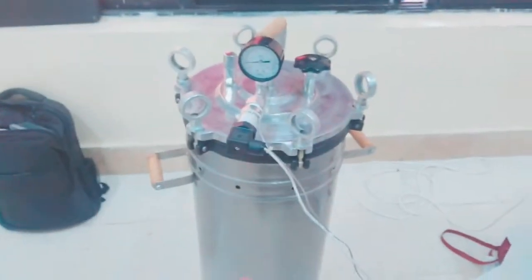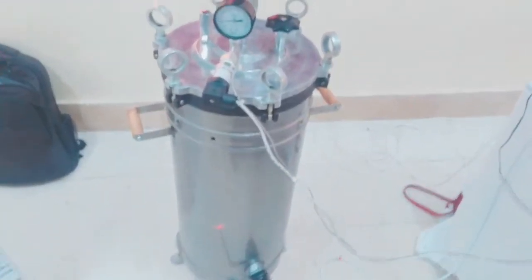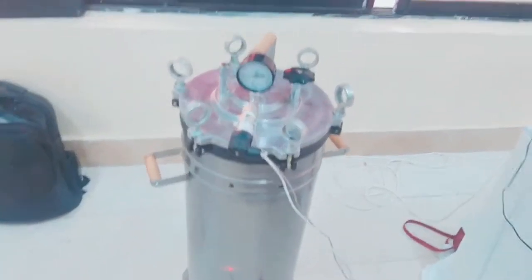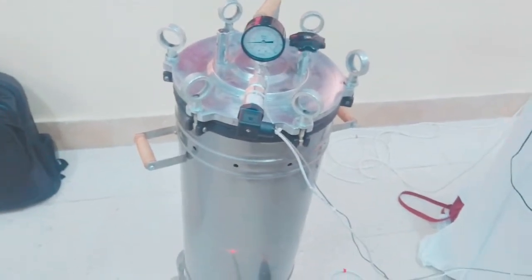How does this work? It has to clean your surgical instruments at a specific temperature and pressure. Any instrument that is surgical requires a special temperature, heat, and steam to be sterilized.